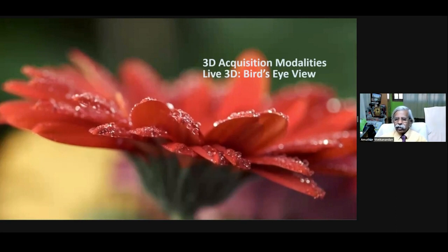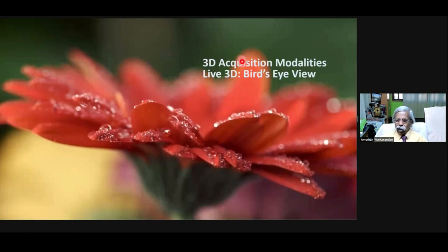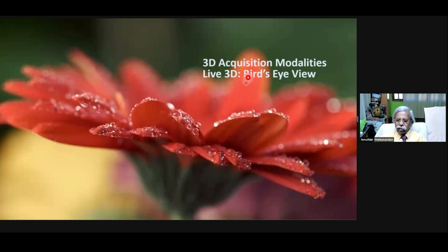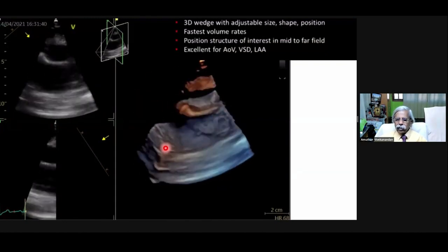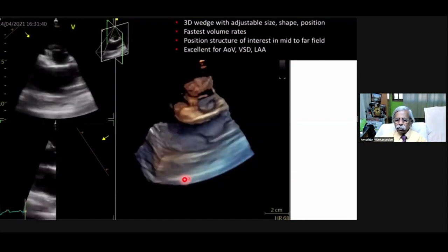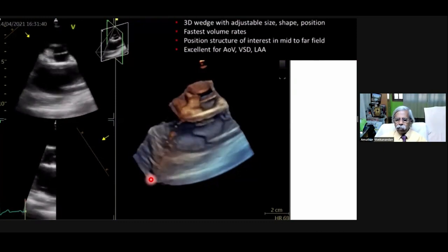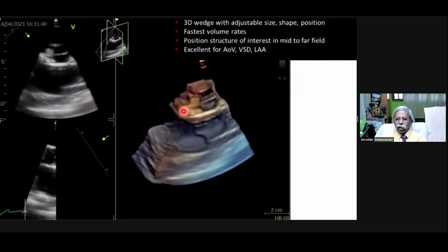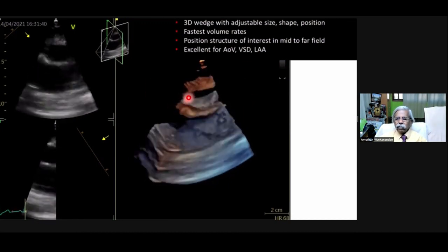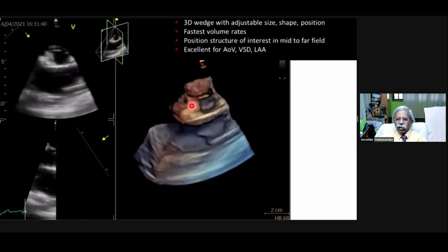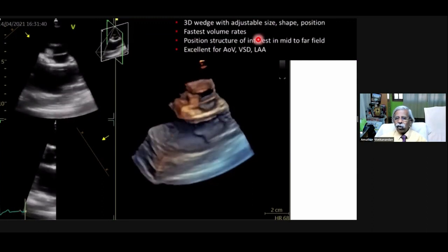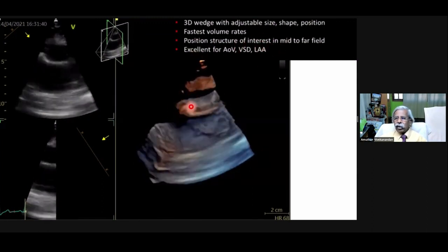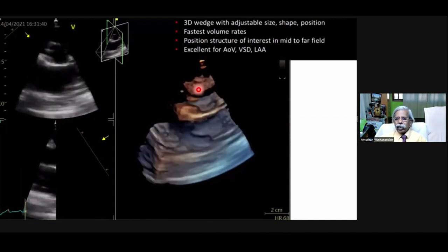For 3D acquisition modalities, before going to the regular full volume, you can go to live 3D — which is a Philips term — or the bird's eye view on GE. It is only 30 degrees in the elevation plane, which is 90 to 120 degrees as you see in 2D, plus 30 degrees in the elevation plane. This is a 3D wedge with adjustable size, shape, and position. It is excellent for the aortic valve and the mitral valve.